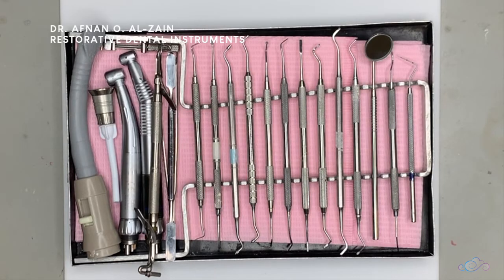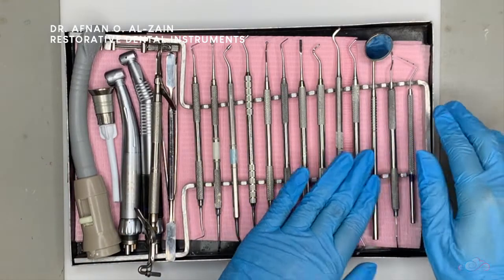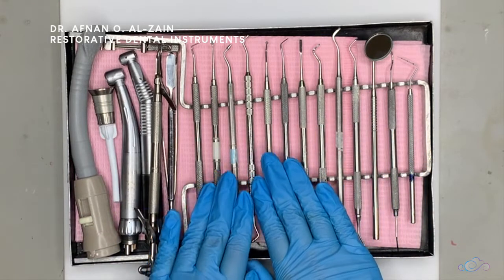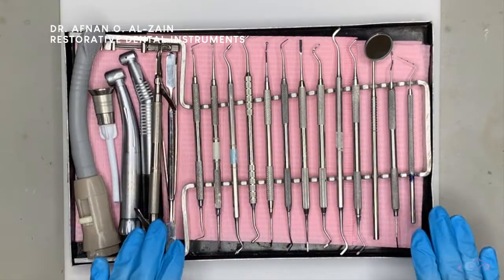Hello everyone. In this video we're going to see the different instruments you're going to use. This tray contains different instruments: the examination kit, cutting instruments, non-cutting instruments including the manipulation instruments, and the handpieces and adjunctive instruments.